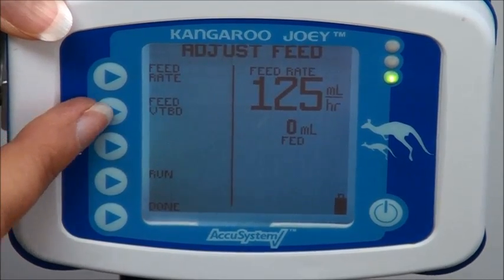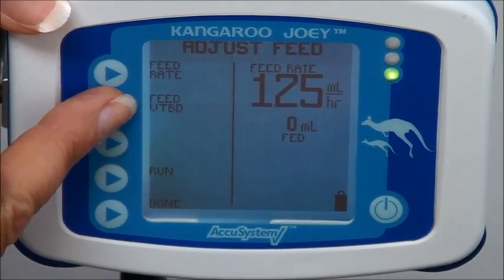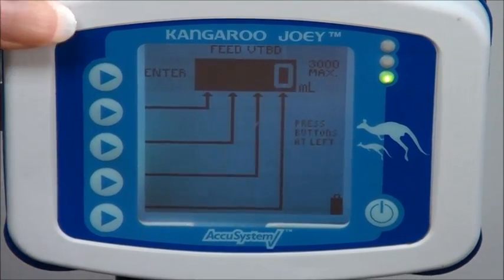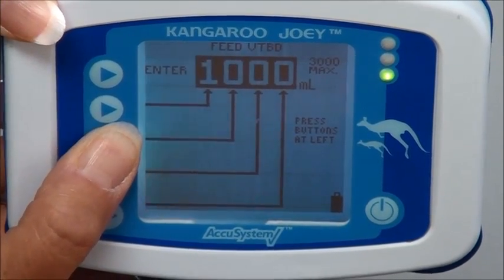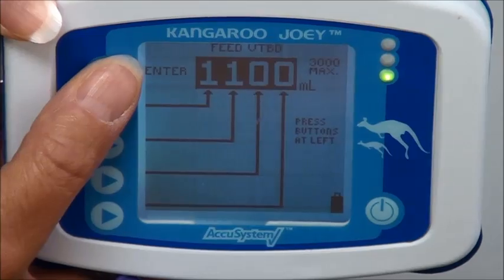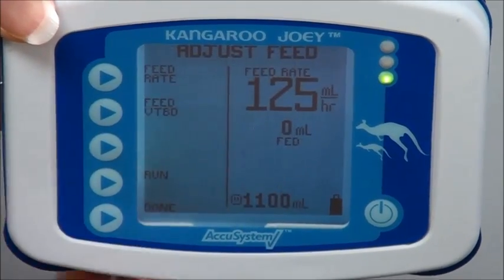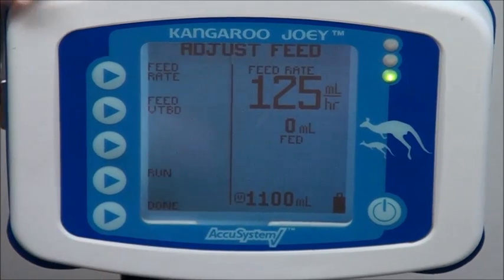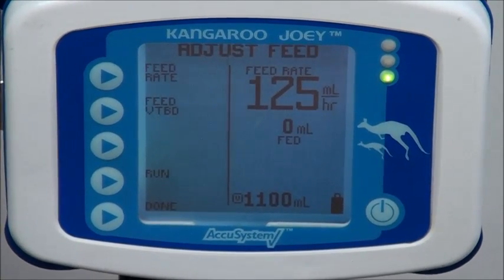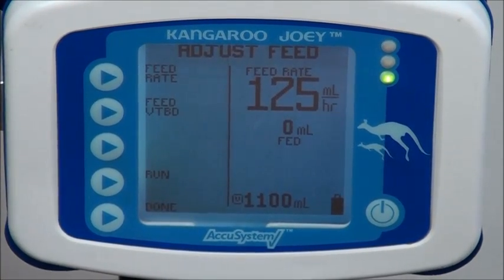And then I'm going to go down to the food to be delivered. I'm going to push that button and I'm going to put in my numbers the same way. So I'm going to put in 1100 and then I'm going to hit enter. And then if I look over on this side of the screen, I can see my numbers that I entered and I know that I have them in correctly. So now you're ready to connect your patient to your tube set.